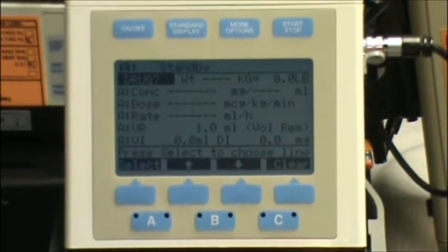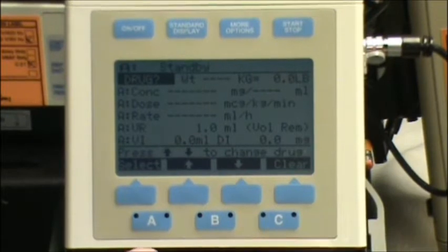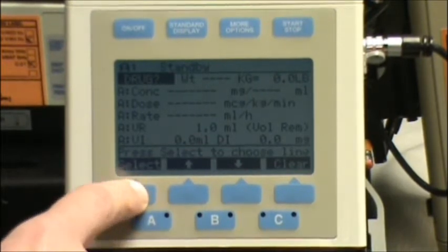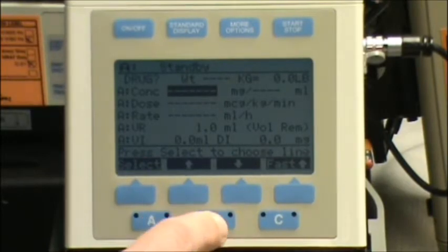vasopressin. And for this simulation I'm going to simulate that I have an order for vasopressin at .04 units a minute. So I'm going to hit select and bypass the weight because I know that vasopressin is not weight based.